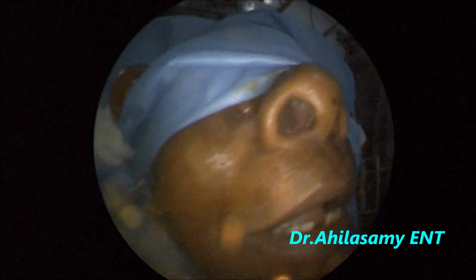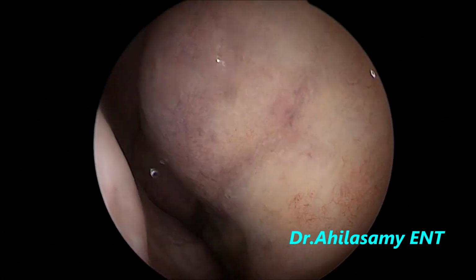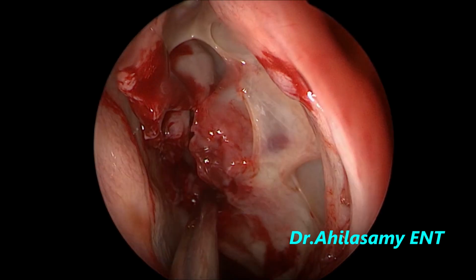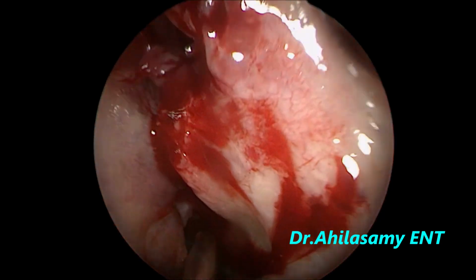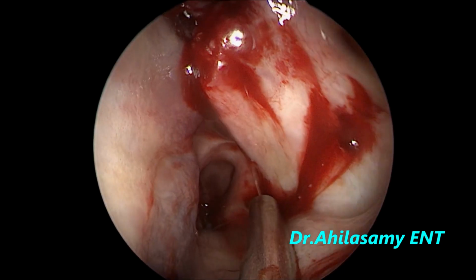So we don't routinely pack the nasal cavity after any FESS or septal surgery or turbinate surgery or even for tumors. So hardly any bleeding. Appreciate the field quality under local anesthesia. And the patient will be discharged on the same day as a daycare procedure.